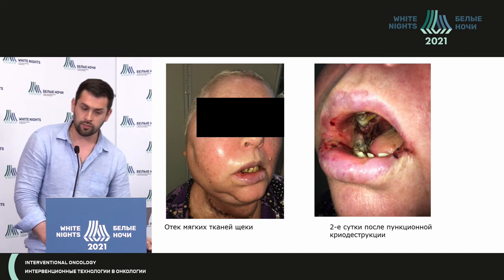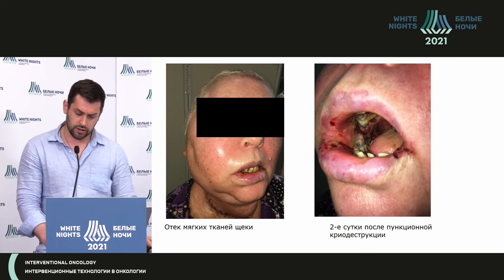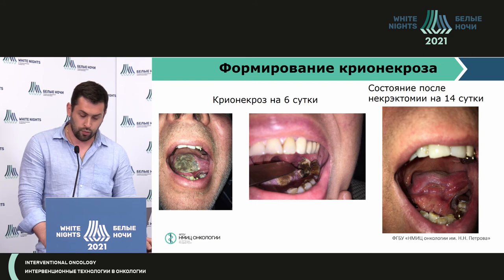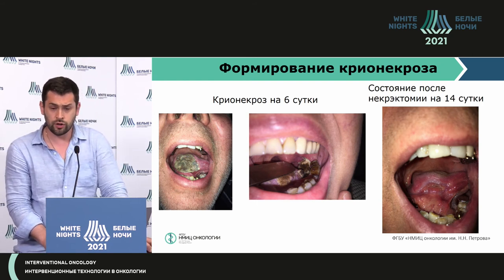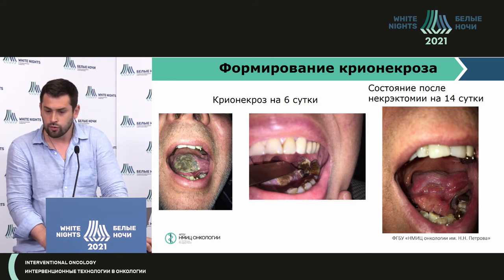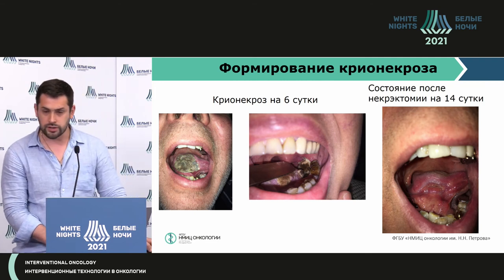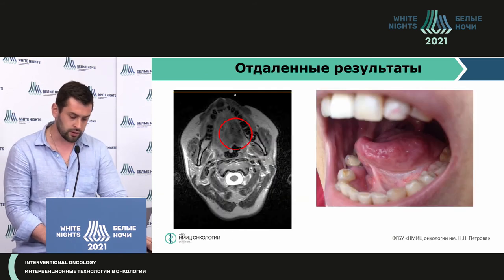We see the edema on the second day after puncture cryodestruction. Edema is expected at the second day after the surgery; post-surgery, it is at its maximum. On the sixth day, the cryonecrosis is formed. And on day 14, we remove necrotic tissues. You see the stage after necrectomy on day 14.